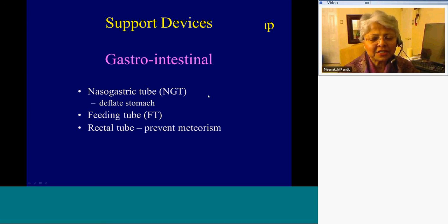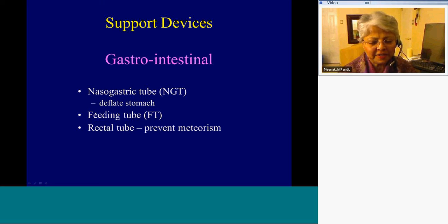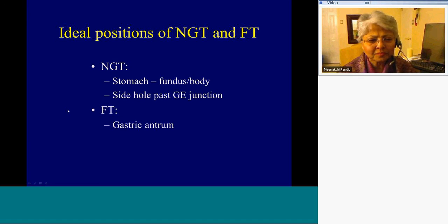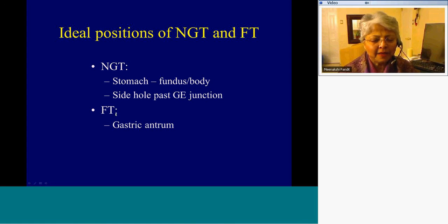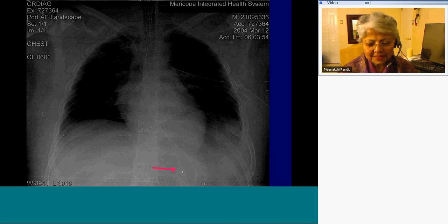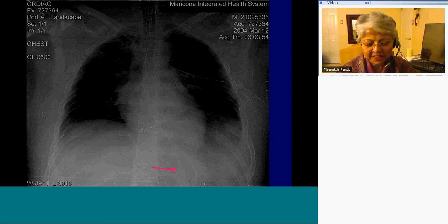Finally, the gastrointestinal support devices — the nasogastric tube and the feeding tube. The intended position for the nasogastric tube is the stomach, either in the fundus or the body of the stomach, and always mention the position of the side hole — it must be past the GE junction. The feeding tube must be in the gastric antrum. This is a good position for a nasogastric tube: the side hole is well past the GE junction and the tip is probably in the body of the stomach.